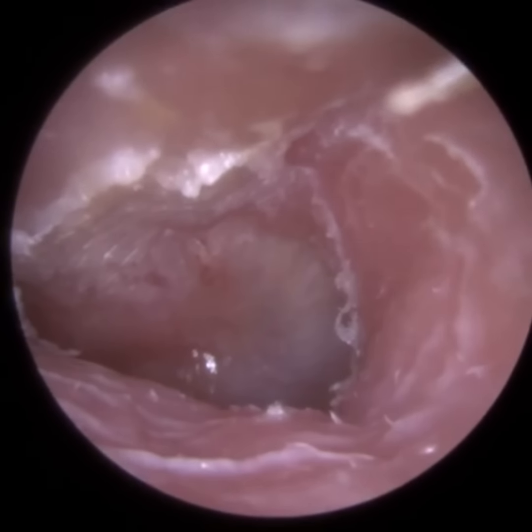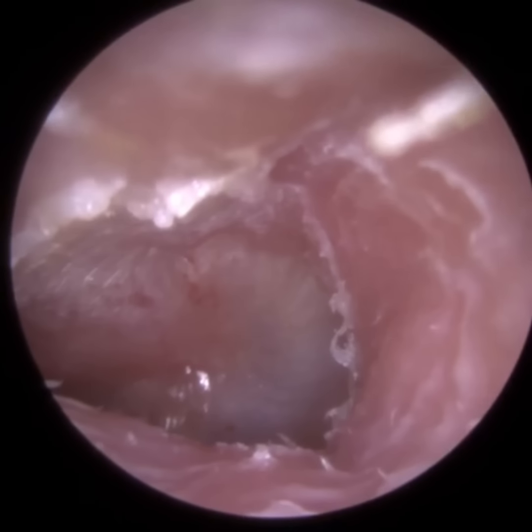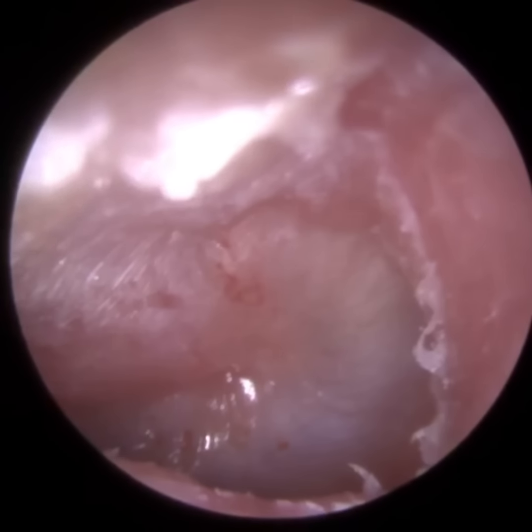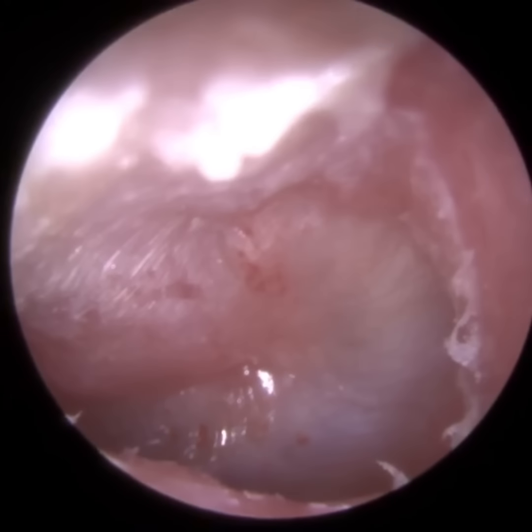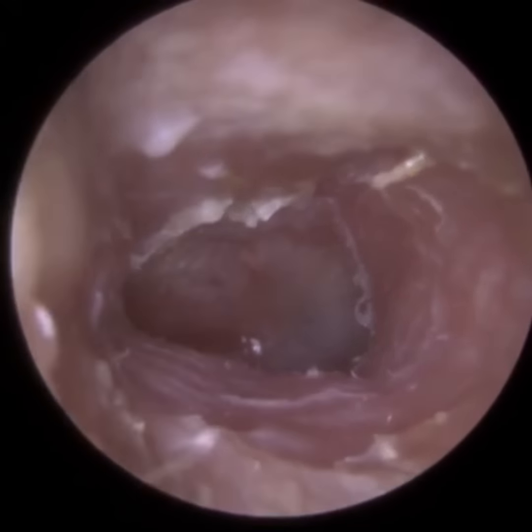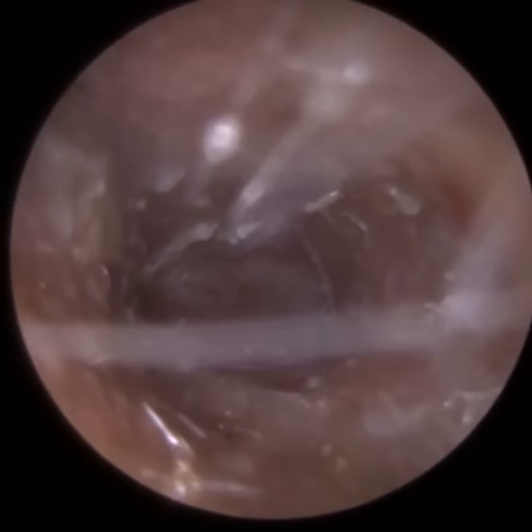You're going to get a close-up of the eardrum now, so we're going to go really deep into the ear. Again, just going to make sure that the endoscope itself doesn't touch the ear canal. There's the eardrum, slightly inflamed because of the plug of skin, otherwise it's functioning fine.